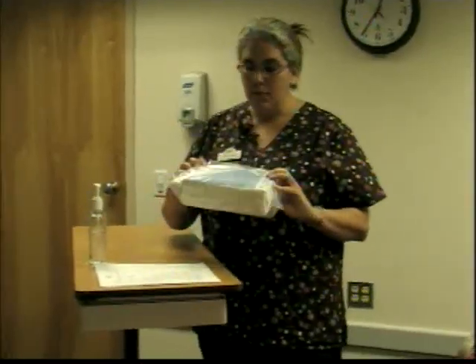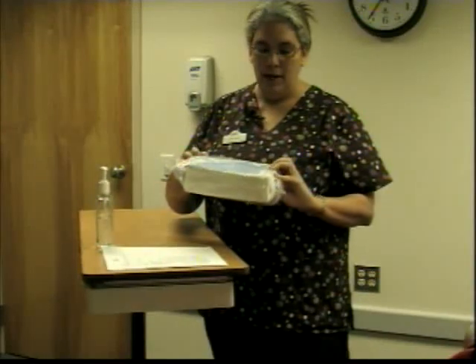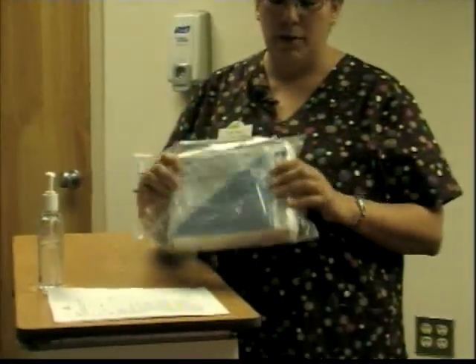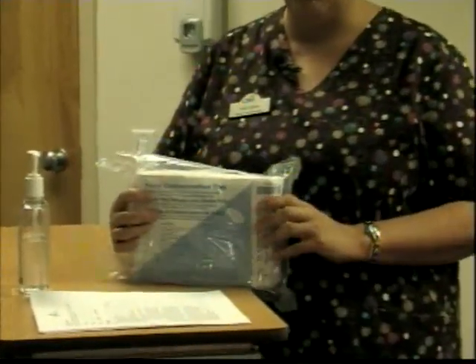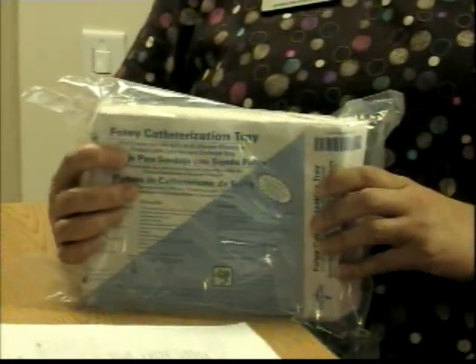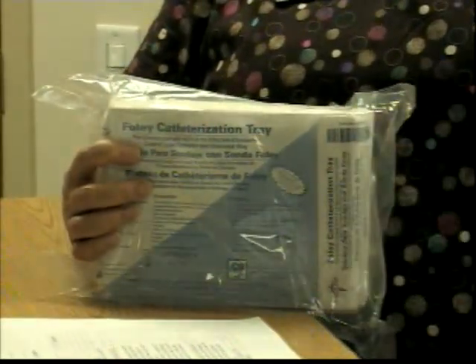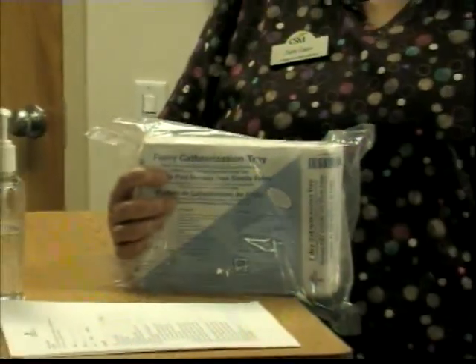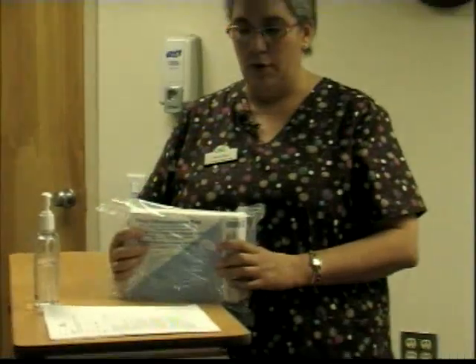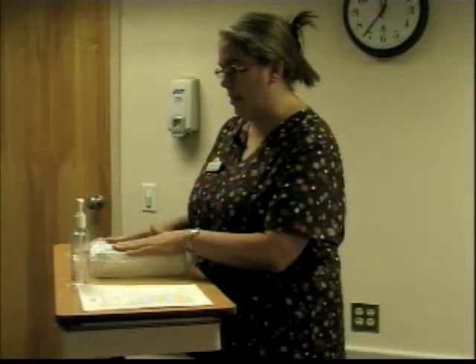Now looking at the equipment: for females, we usually use anywhere from 14 to 16 French. You'll look at the size on the packet — this is information to obtain from the medical history or chart. If they've had a Foley before, what size was used? The more frequently Foley catheters are placed, the larger the urethra becomes, and you may need a bigger size. Males are usually 16 to 18 French. The one I'm using here is the 16.